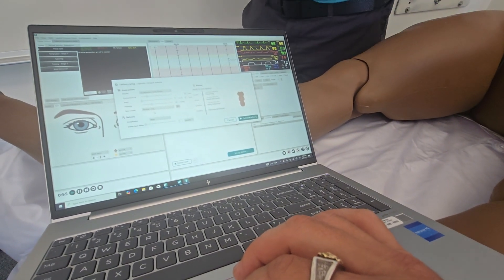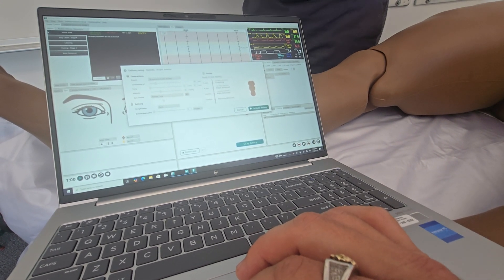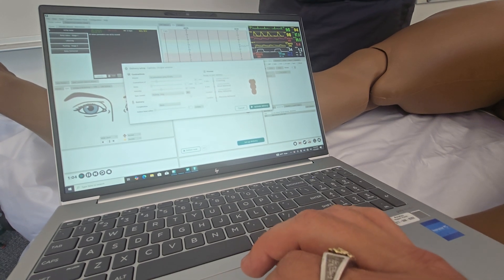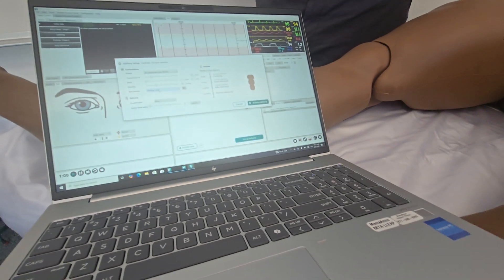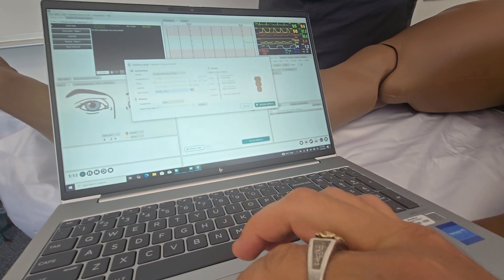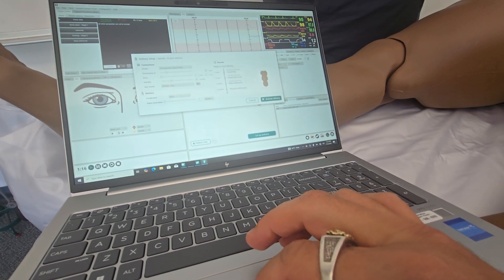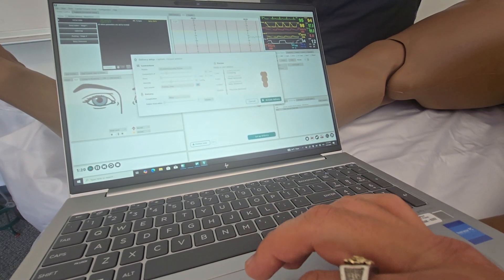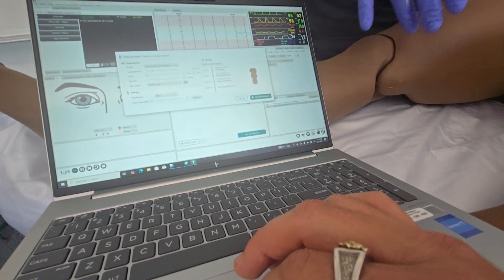You also have the ability with this new setup screen to set up contraction sounds — similar to what you have in the vocal bank in the sounds panel of Leap. The pushing long sound is pretty standard for normal contractions. On the right there you'll see that the sounds have been muted — we're going to turn those on by hitting the mute icon. You can also run the delivery without any moans or anything like that.